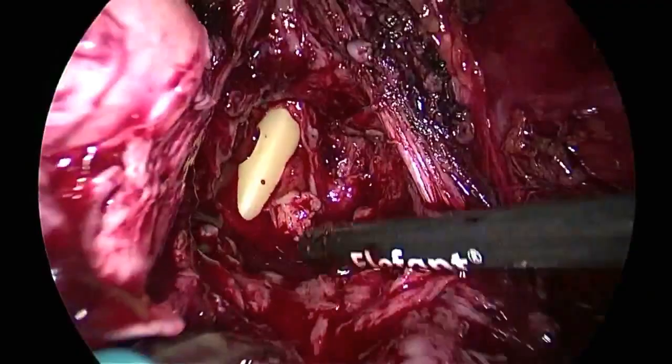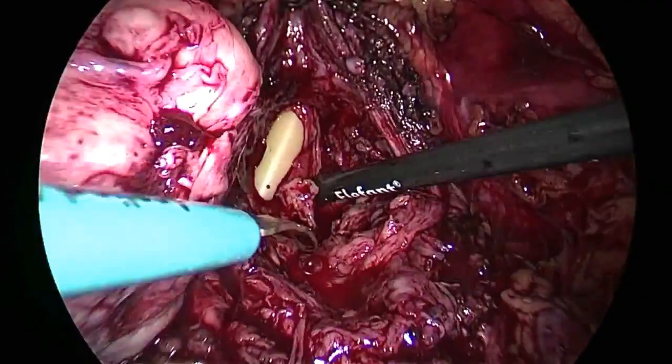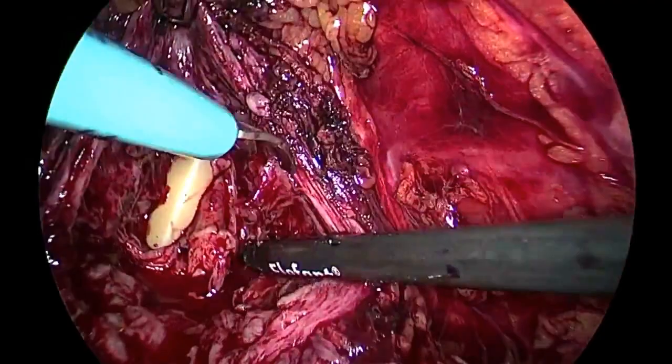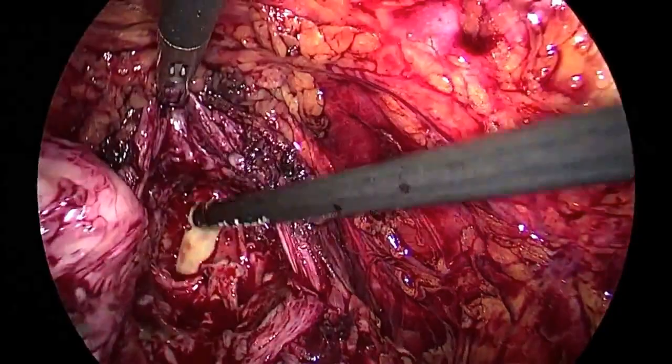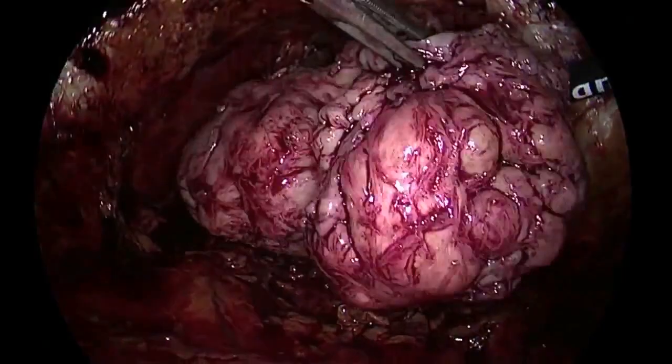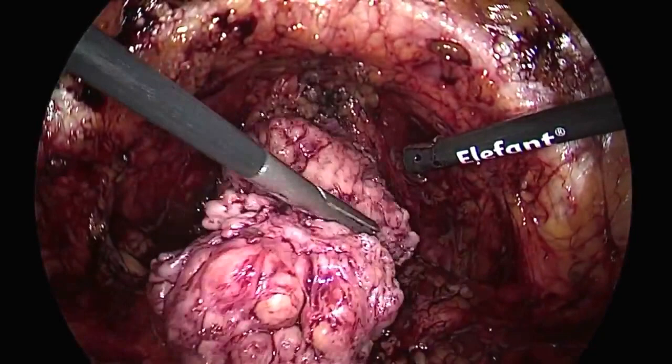And now I put the adenoma in the bag, and I perform typical trigonizations. As you can see, the bleeding is very low, and so the capsula is perfect. Obviously, there is a little bit of irregularity that could be correlated with the previous biopsy that has been done in this patient. Okay? And the bag, please. So this is a typical multinodular adenoma. I don't know the weight, but it could be about 78 grams.